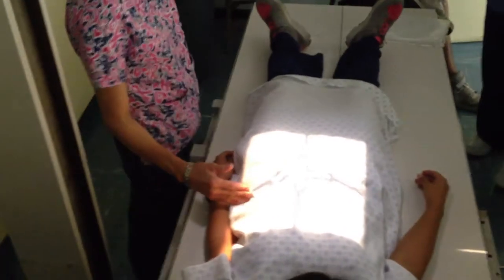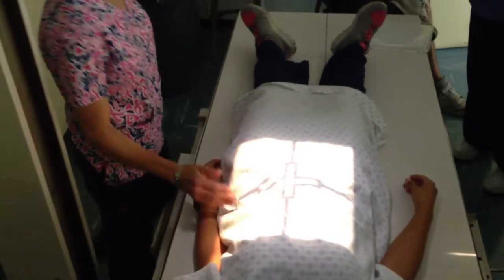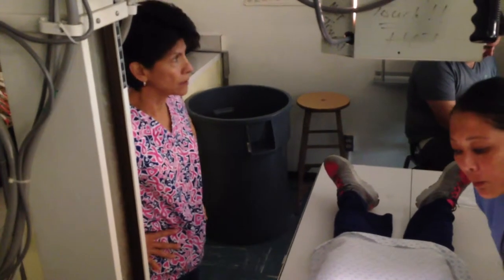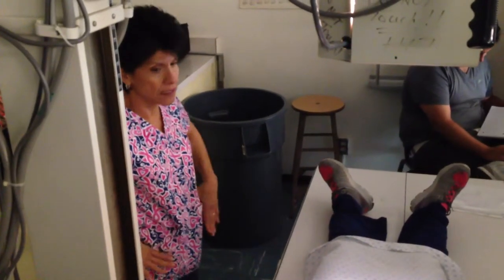Should this one be at crest? No, three fingers. No, this is abdomen. Your overhead on your first stomach should not be at crest, guys. You're going to clip off the fundus. It's got to be above.